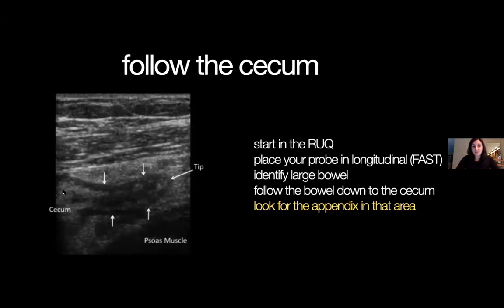So we followed this, so this is cecum, it was dirty gas, you can still see that there's a lot of shadow, and whoop, all of a sudden, you see that little tubular structure that is a blind pouch, which is something we're going to talk about a bit later. And you can see underneath is actually the psoas muscle. So anatomically, it still makes sense, but you're using a different technique to find it. And again, I know that sounds a bit complex. I agree. It's something you really need to practice and have very good dexterity to follow this. Yet it's a good tool in your pocket.